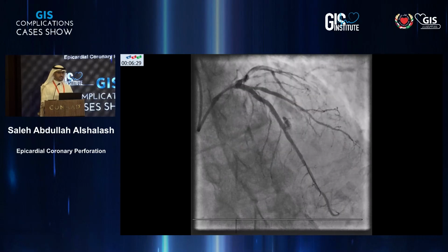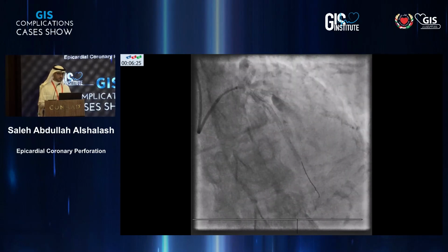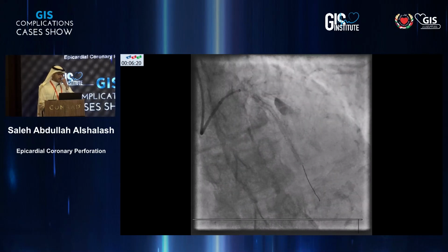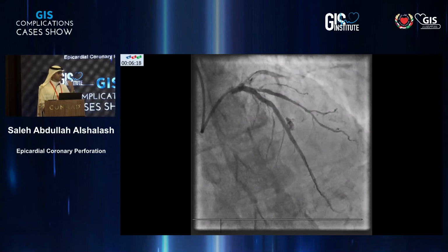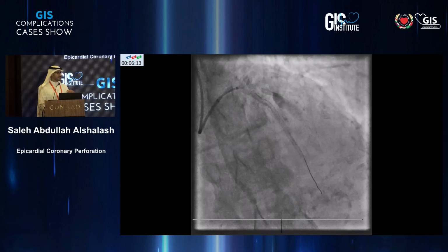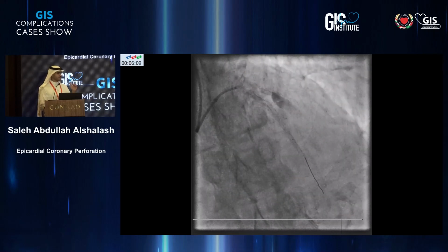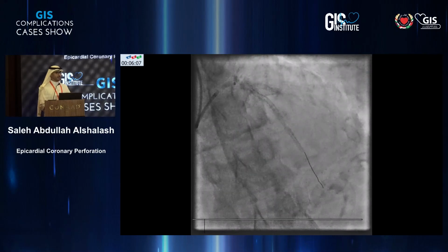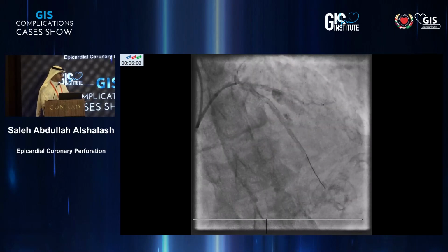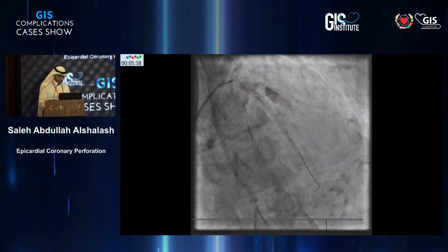Again, patient is extremely happy. We're chatting, really nothing wrong with the patient. I put the balloon back in, I inflate it, and the first balloon stayed up for 10 minutes. This I aimed for 20 minutes and I deflated at 18 minutes just because he started having chest pain and he started flipping his T-wave, and I really did not want to deal with clots and bleeding. So I thought 18 minutes is probably close to 20.